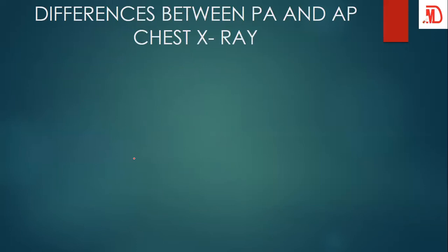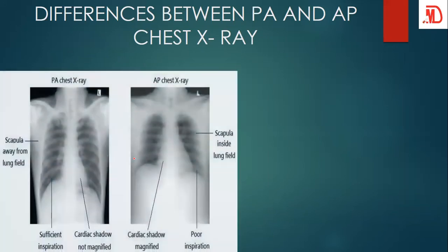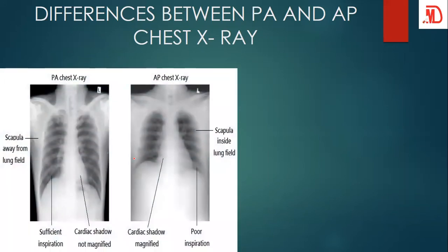So now here comes the differences between the AP and the PA. So good, we have this at our disposal. Very nice diagrams, right? We can tell that the first diagram we showed you was actually a PA view. Like I said, it is the commonest. We only do the AP when the patient cannot stand.